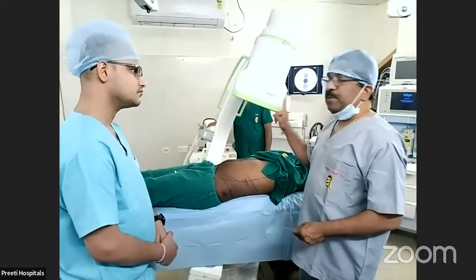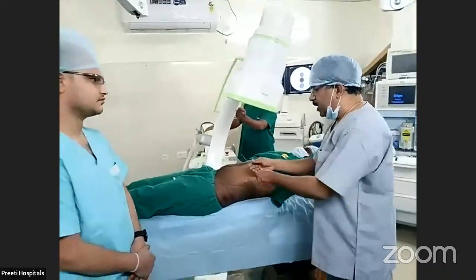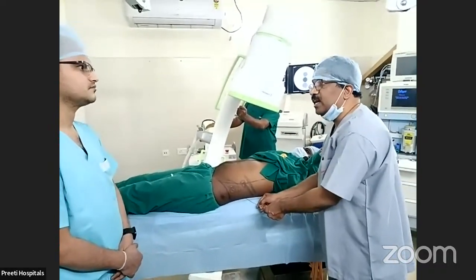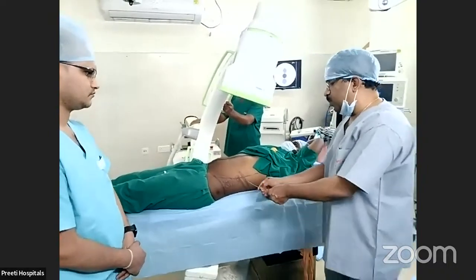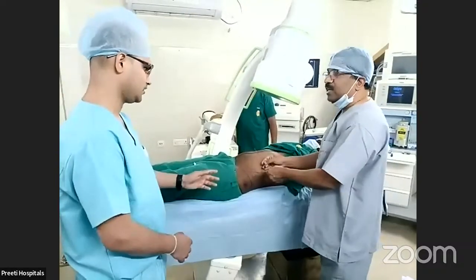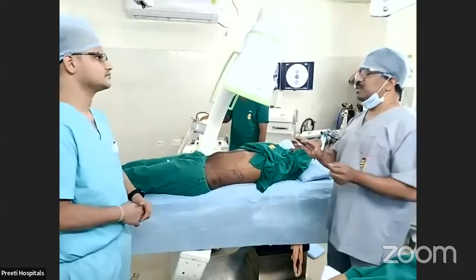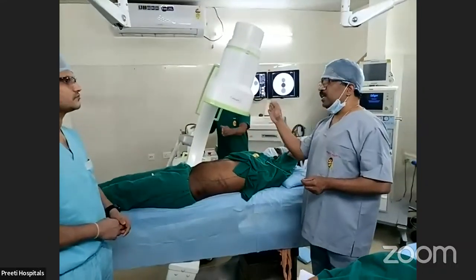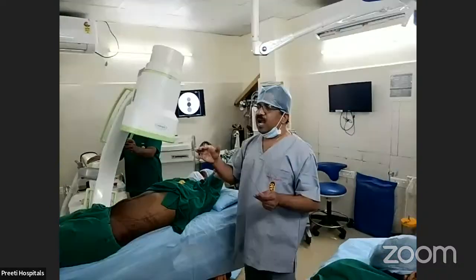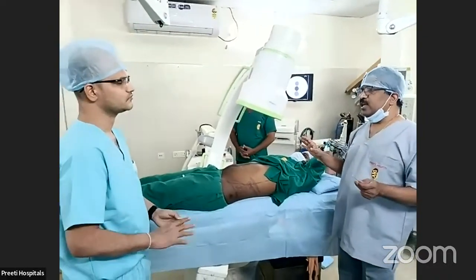To conclude, in supine PCNL, if the C-arm receiver is 30 degrees up and the needle goes up, it is good, you are more superior posterior. Withdraw and go more anterior. If the needle goes down on the screen, you are more anterior, which is not required, so go more posterior. That's all. Either way you can do it if you remember.